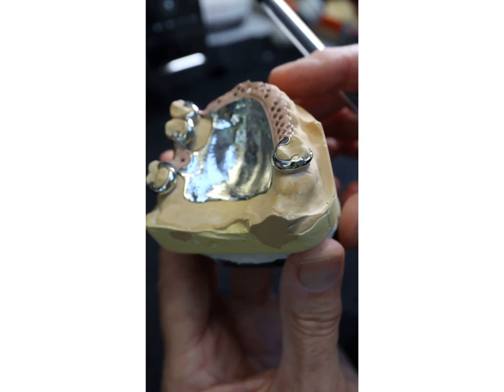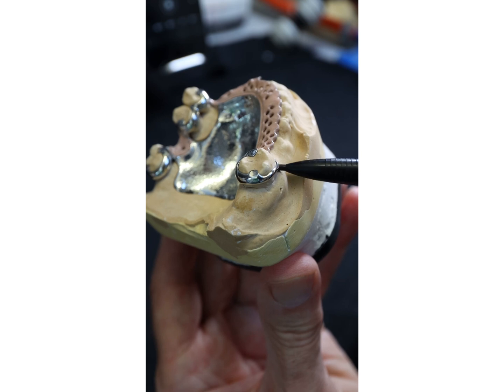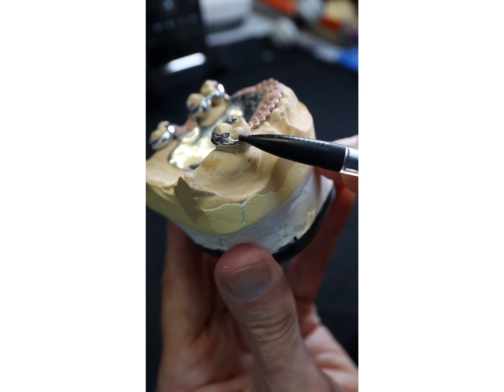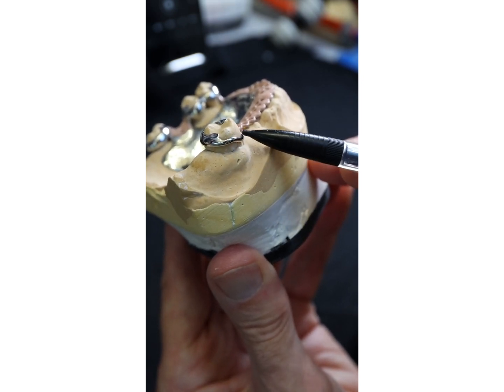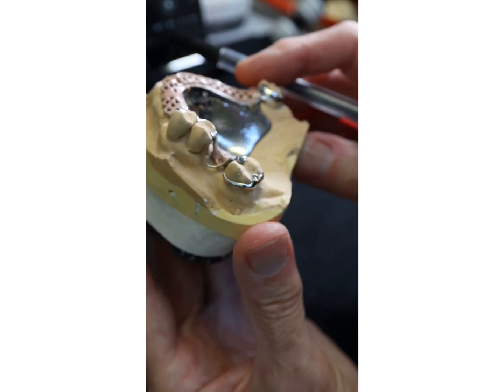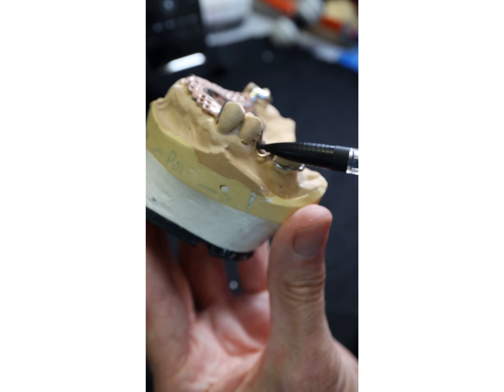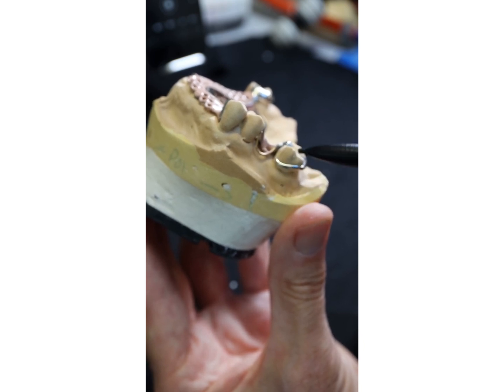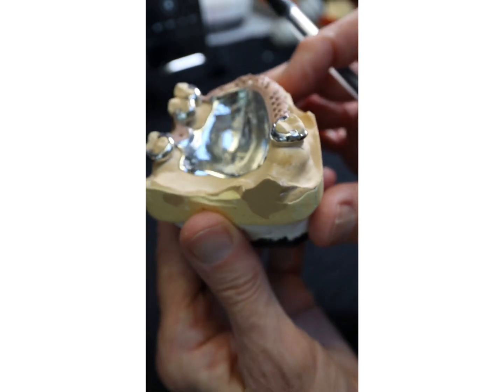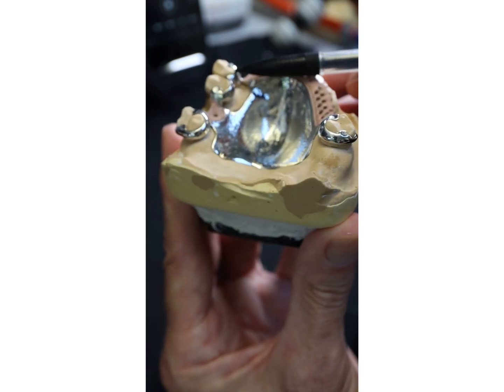As I said the other day, and somebody expressed surprise — hence the explanation now — you lightly clasp teeth. Lightly clasping means don't engage too much undercut and use flexible clasps. Clasp arms are and should be thin and tapered towards the tip, so they're flexible. The more flexible they are, the less stress they'll put on the teeth and the patient. Round wires will flex better than D-shaped section. And you don't need to engage much undercut on these molar clasps because we have the frictional guide surface retention provided by the denture base against the teeth.